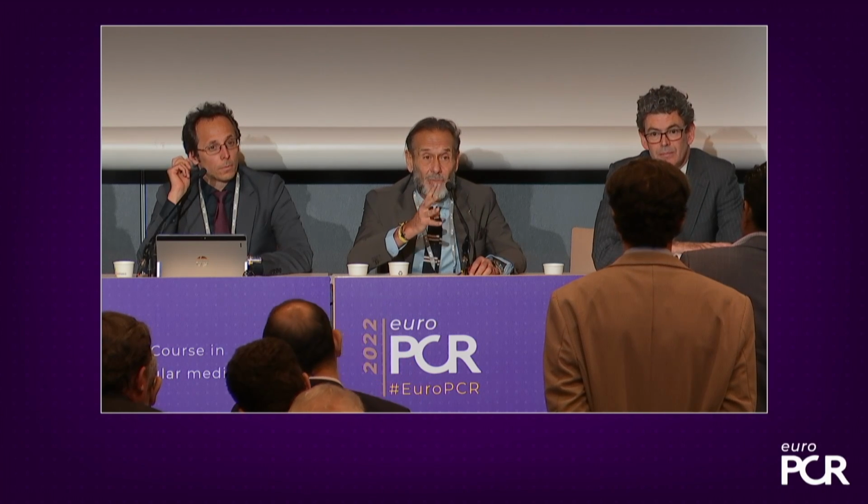spicule. If you have a perforation with an OPN or with a non-compliant balloon, maybe it's the balloon, because in this case the dilation is 4 atmosphere. It's not a dilated balloon. I think that in terms of perforation it's safer than an OPN or the other balloon.